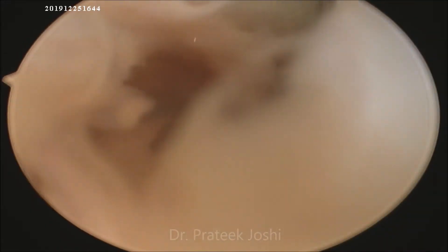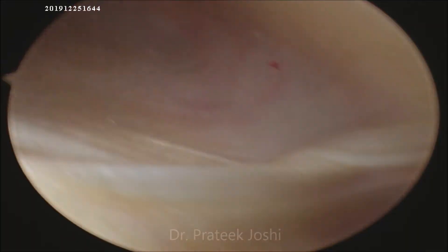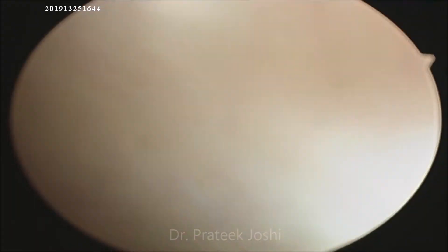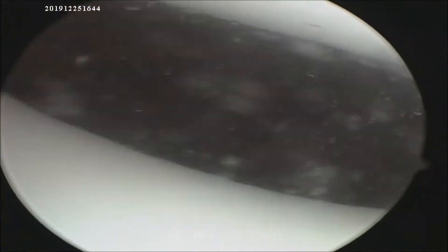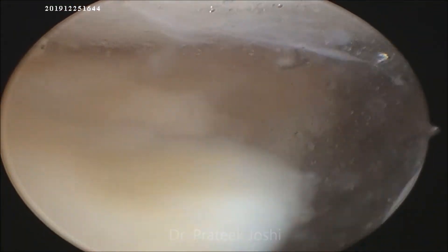In the diagnostic arthroscopy we will inspect the lateral gutter, medial gutter, suprapatellar pouch, as well as the patellofemoral articulation. There are grade 1 to grade 2 cartilage changes visible in the medial as well as lateral patellar facet.